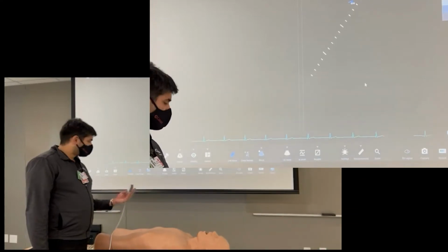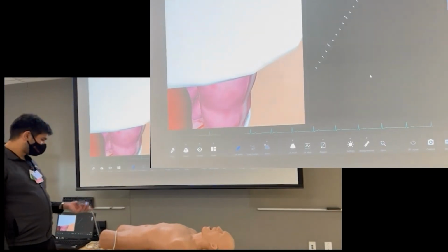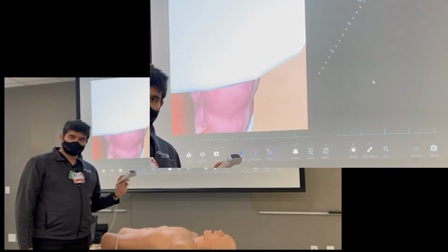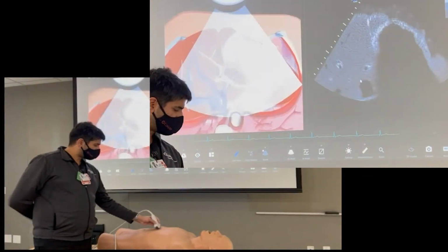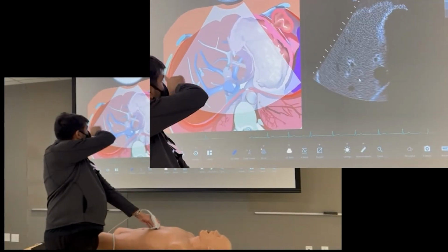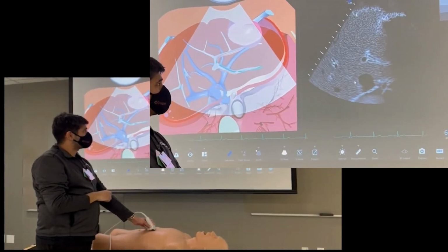Alright, so we're going to talk briefly about how to do an actual aortic ultrasound. So this is the high fidelity mannequin you guys are going to be using. So first and foremost, probe marker will go to patient right as always to start off. The goal is you're going to start with the probe right underneath the xiphoid process. And I'll leave anatomy on the screen as well. So you can see liver on the right. That's what liver looks like on ultrasound, that mixed echogenicity stuff there.